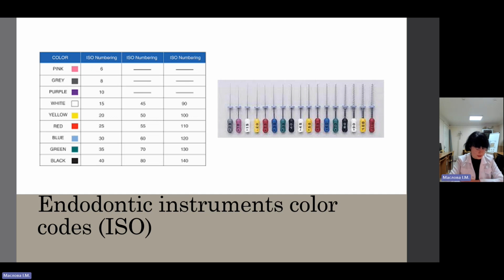Coronal interference influences the force a file will exert within a canal. This is of particular importance in curved canals, where files may prepare more dentine along the furcal wall as opposed to the other canal wall. It is important to be aware of this, to limit the size of enlargement in curved canals and direct files away from the furcal wall to avoid a strip perforation.